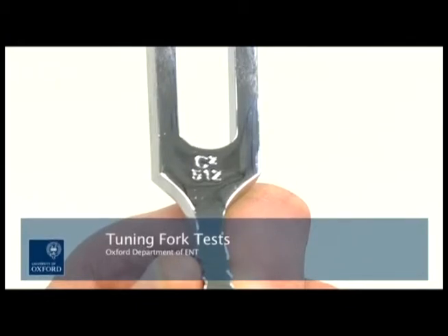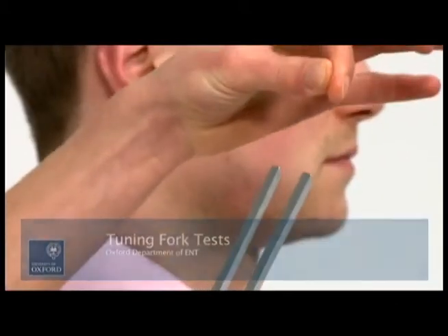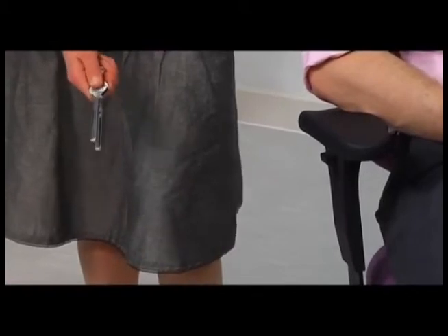This video shows how to perform Rinne and Weber's tests. These tests are performed using a 512 Hz tuning fork. The tuning fork can be activated by flicking it between your fingers or by tapping the tuning fork on the knee. It is important to explain the test clearly to the patient.